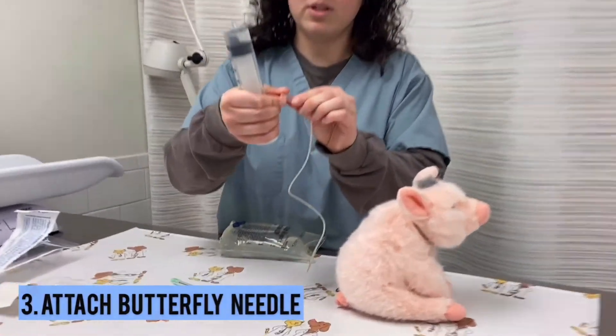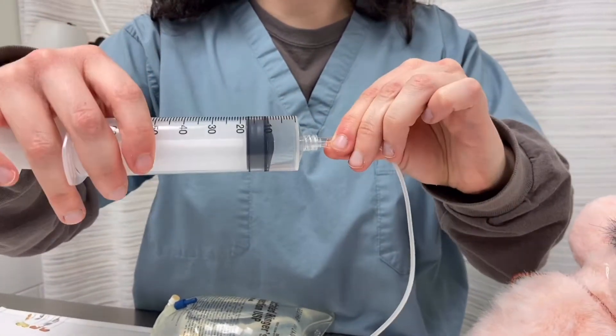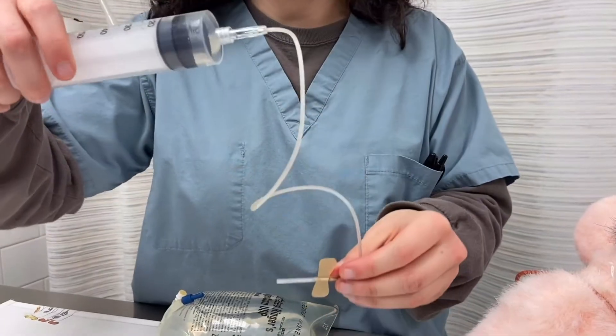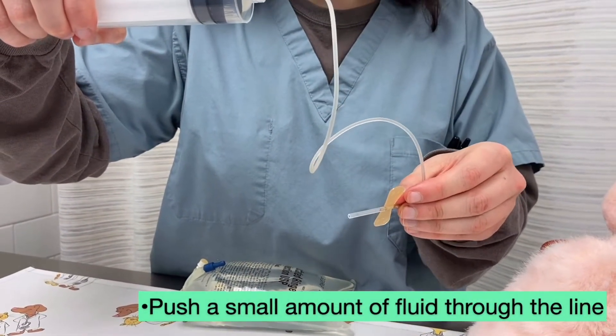Take your butterfly needle, take the plastic cap off the top, screw it onto the syringe, and push the plunger to help a little fluid go through the line. You want to make sure that you're not giving any air to your pet.